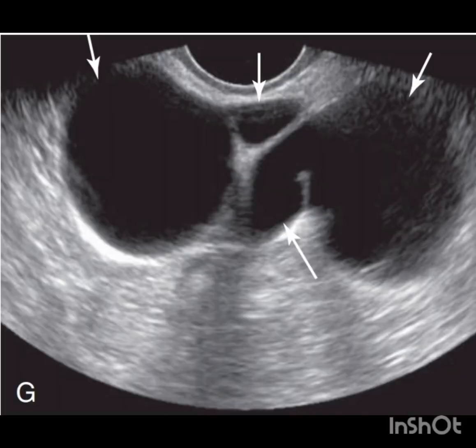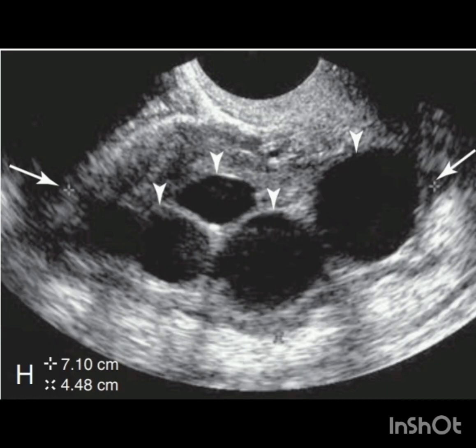In this image of hydrosalpinx, you can see focally dilated areas and multiple components. So it's a bit different from the usual tubular structure of hydrosalpinx. Again, in this image of hydrosalpinx, you can see multiple components with focally dilated areas, and it is basically an image in the cross section.